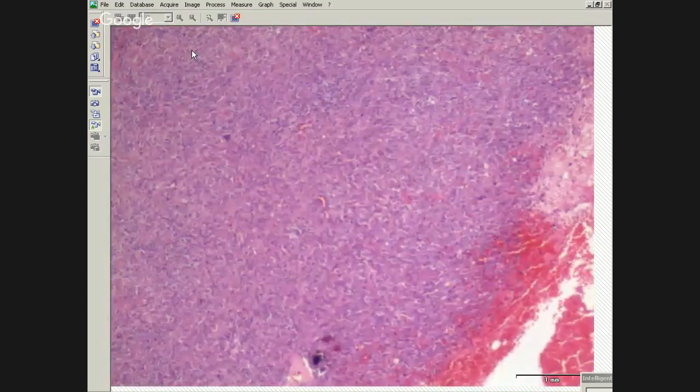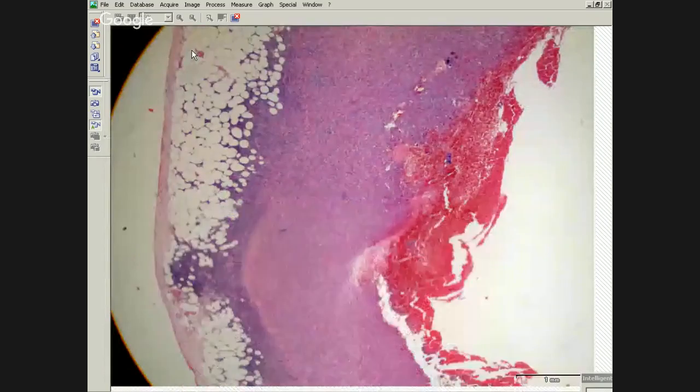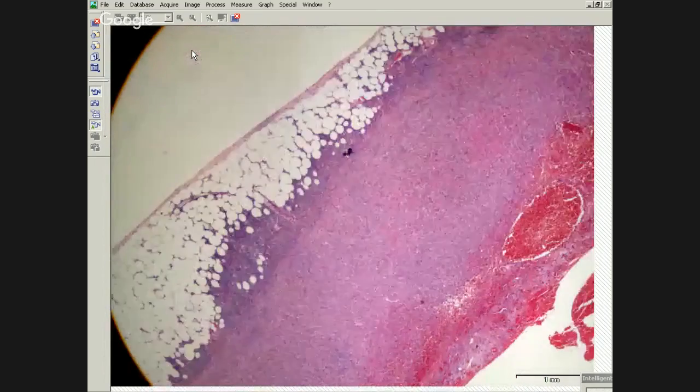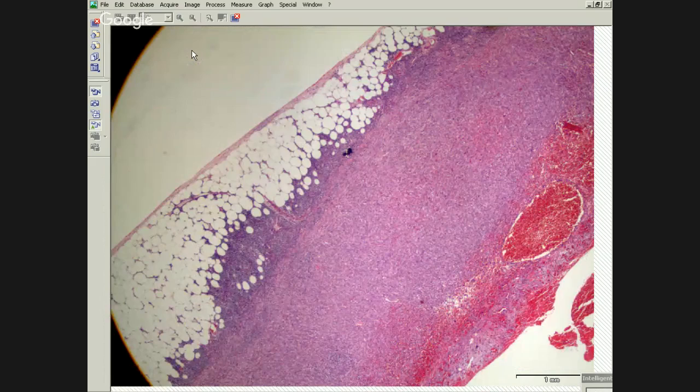Okay. Sorry, I have a question about the previous one. Would you call this well-differentiated papillary mesothelioma? No, well-differentiated papillary mesothelioma is a completely different entity. That's more common in the peritoneum. They have rarely been reported in the pleura, but those are typically small.